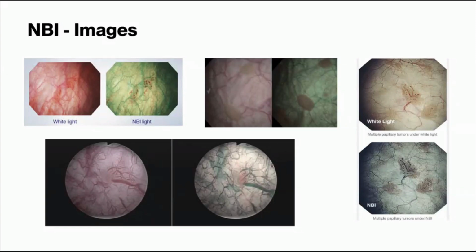And then you can also see the top middle there, papillary tumors seem to pop out a little bit more against the background contrast, appearing more red, presumably due to superficial vascularity in them. And then another example on the left there.